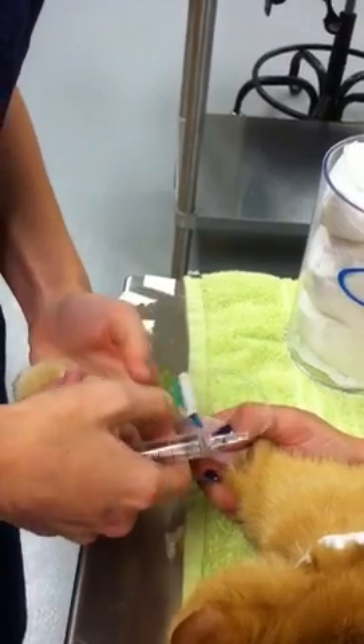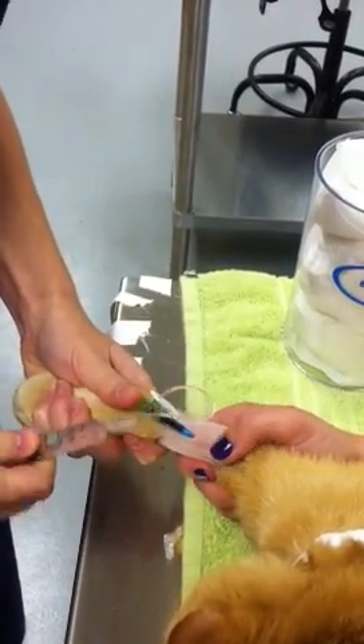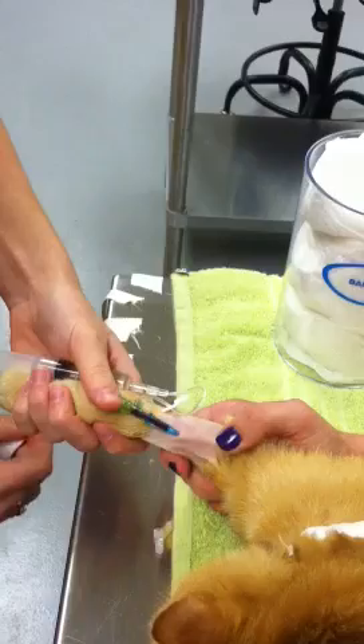I'm going to pull back to make sure that I am still in. Now I'm going to roll this to the outside here, and that's so later I have easier access to it.